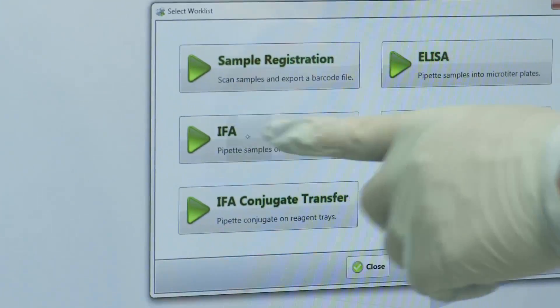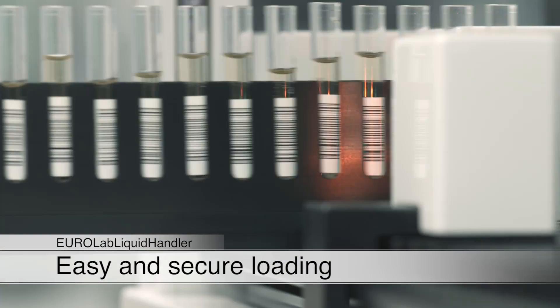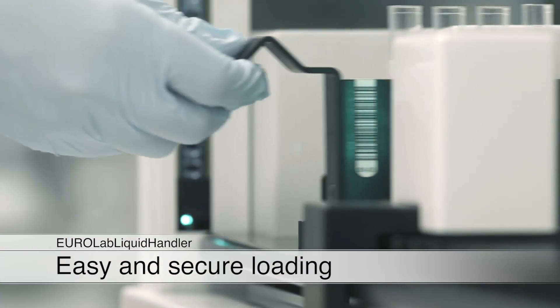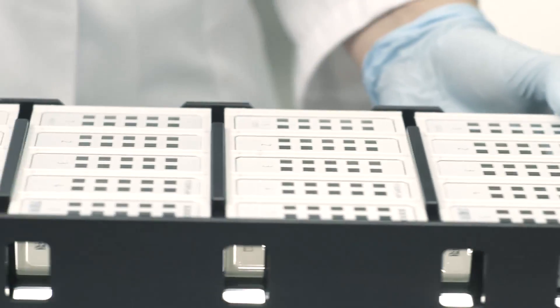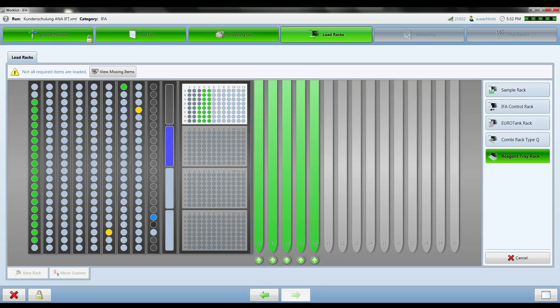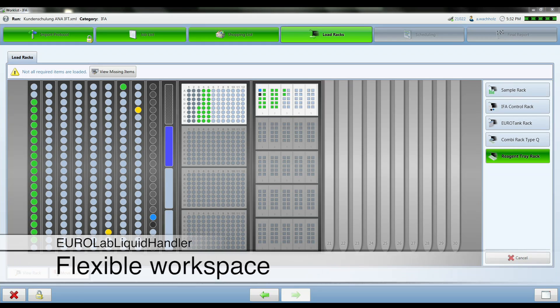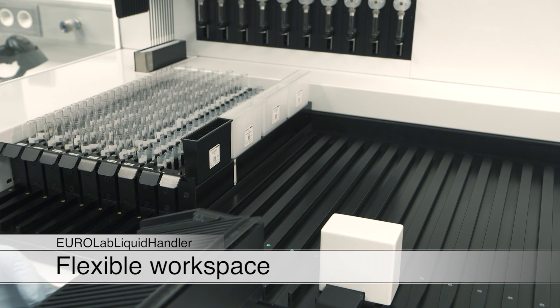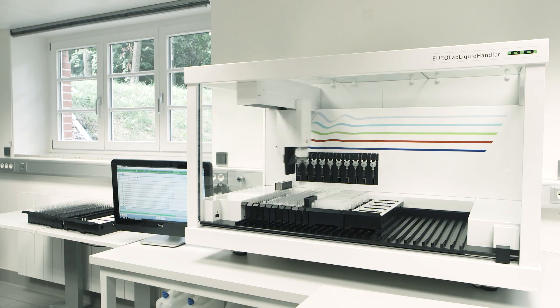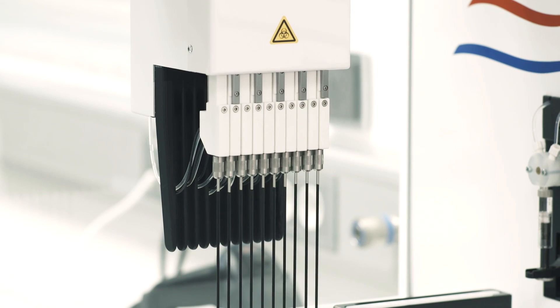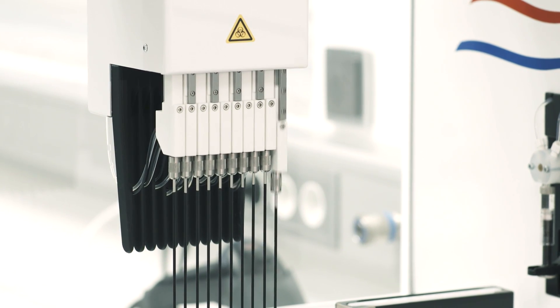Owing to the modern and intuitive software, the handling of the instrument is quick, simple and safe. Bar and matrix codes allow for clear and automated identification not only of the samples, but of all articles used by the instrument. In addition to the immunofluorescence, also blots, ELISA, or individual liquid handling applications can be processed.